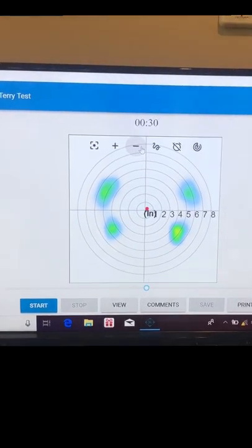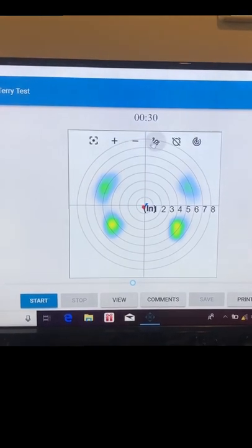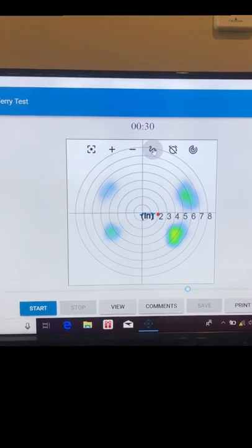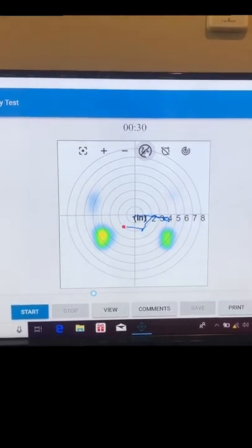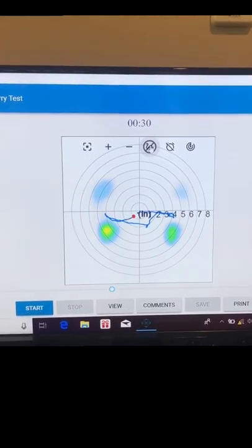Now this is important. This little squiggle up here appears when you're actually getting the patient to move. When you're beginning to save data, if you don't want that trail to follow the COP, you can hit it to turn it off, or you can turn it on.